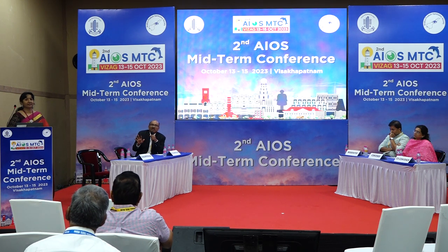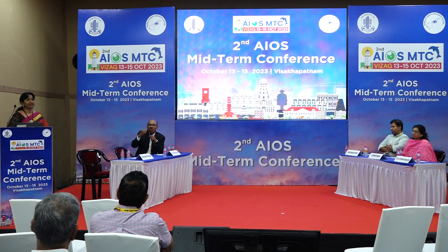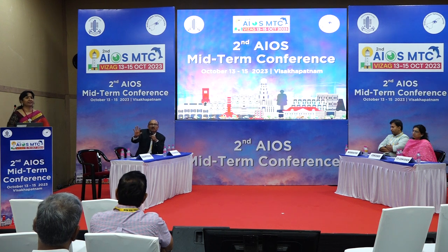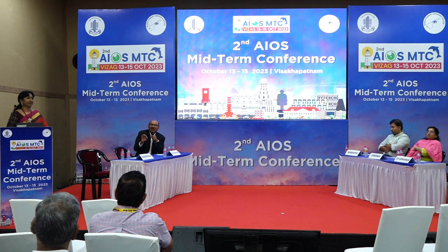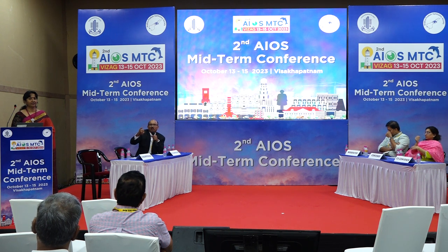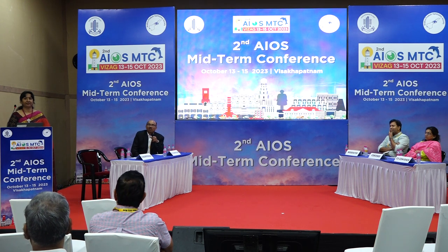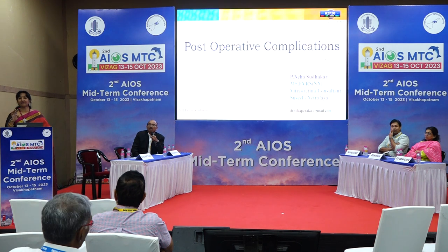The commonest thing is the refractionist. We throw them on the refractionist, do the scan, do the IOL master, do that. So that is the source for the errors in our setup. So rely on one particular fellow or one or two fellows who are committed for it. Not generally pressing a button and getting the result, isn't it? That is the common source of the biometric errors. Any questions?